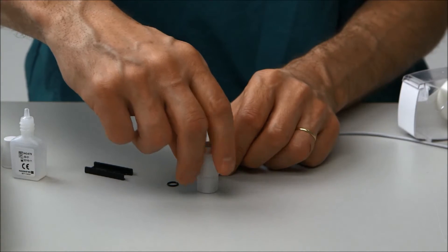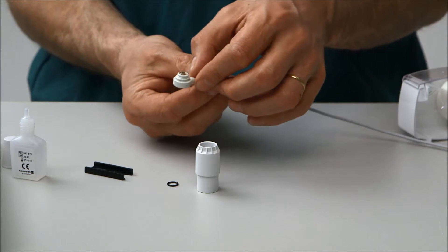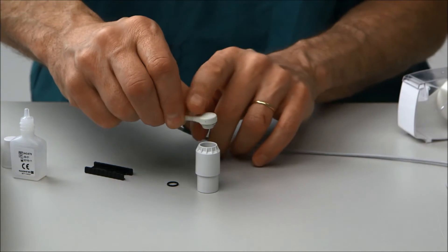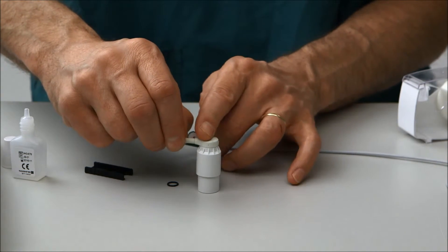Place the membrane unit on a flat surface. Turn the electrode and place it into the top of the membrane unit. Press the electrode firmly until you feel it snap into place.